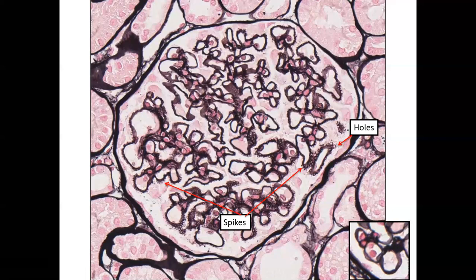Okay, and then I'm trying to see, this one right here, if everybody can see these tiny little discrete holes, this is almost a glancing blow of a capillary loop. And so in my descriptions, when I write these kinds of cases up, I talk about en-face sections of capillary walls. So you basically have a glancing blow of this 3D structure, and you can see these holes are where the deposits are, and this is all the GBM matrix around it.